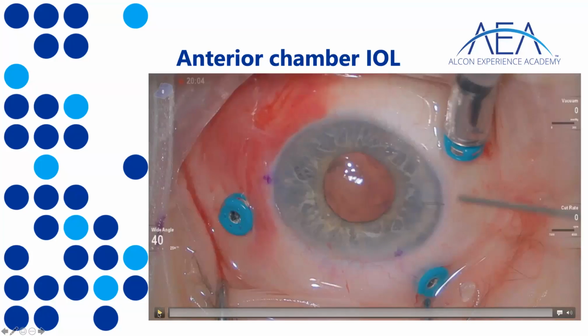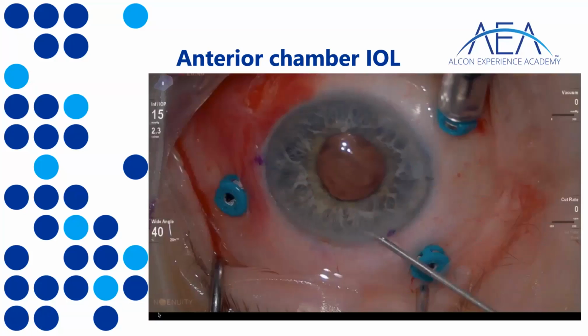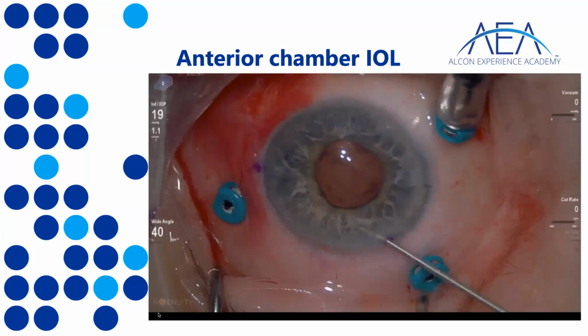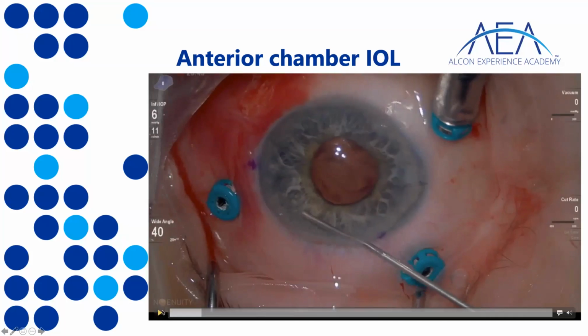So in this specific video, the surgeon started with putting trocars because he's a vitreoretinal surgeon. But the AC IOL can easily be implanted by a non-vitreoretinal surgeon, because in fact the vitrectomy is not mandatory, even if an anterior vitrectomy is usually suggested, and this can easily be done through the pupil.